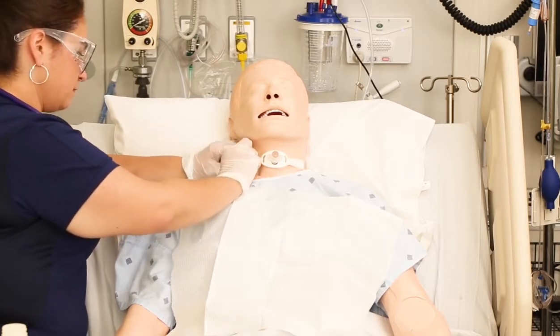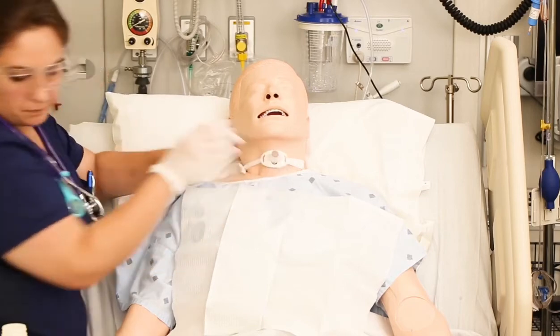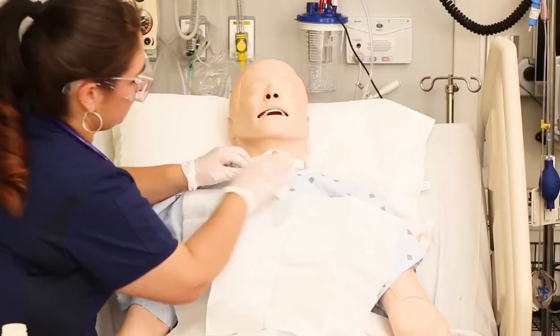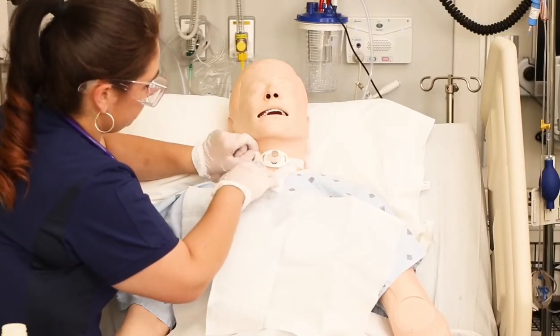Once you tie these, make sure that you can still fit 2 fingers snugly underneath the ties. Too loose, the trach can come out. Too tight, and it can irritate the patient, make them cough, and cause pressure problems.